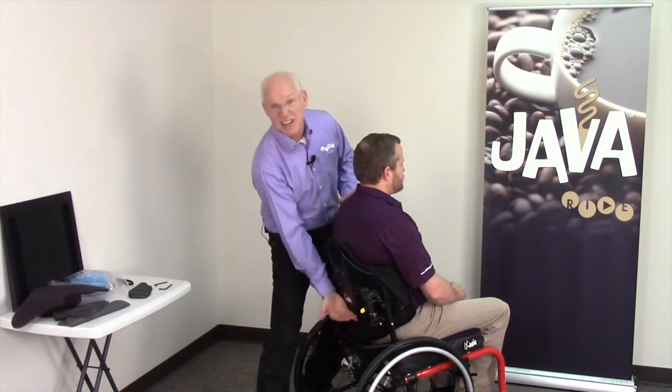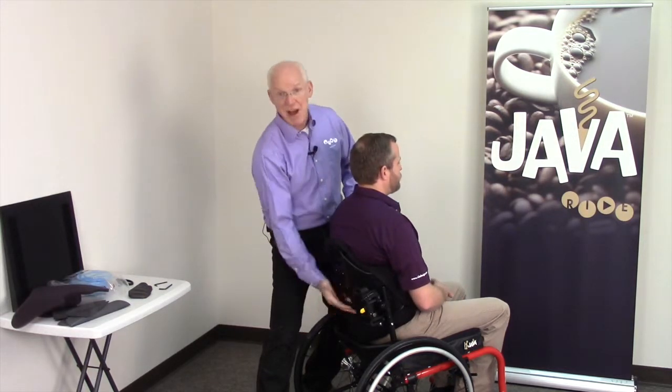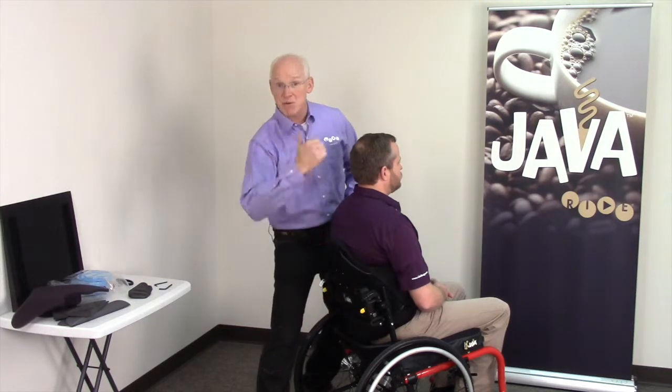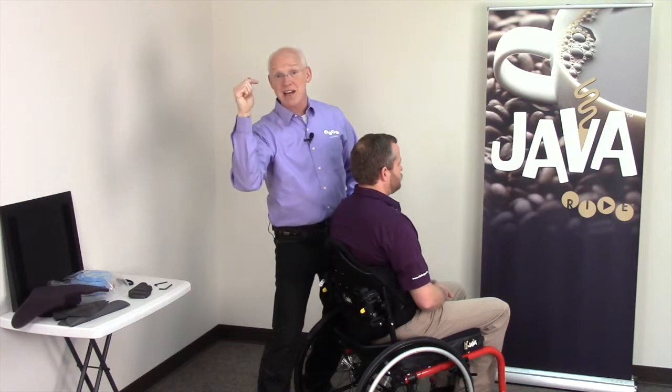With my pivot in place here, I opened up the back angle to let his shoulders come back. Now, what was neat about that, I did that without affecting the pelvis. Everything above that pivot was going backwards. But like all those other competitive back supports that are flat from top to bottom, you start adjusting those back angles, especially when the pivots are in the wrong place. You go above the pivot, you're going back. Below the pivot, you're using up seat depth.